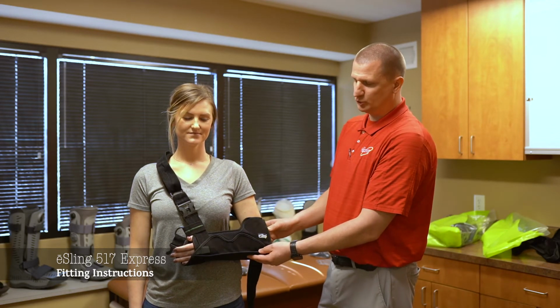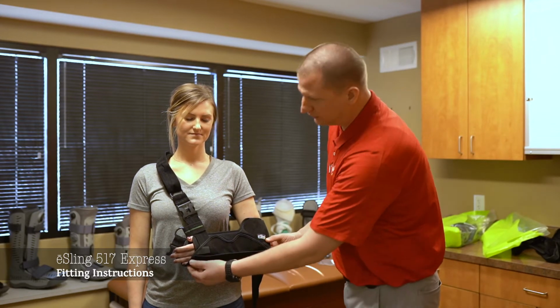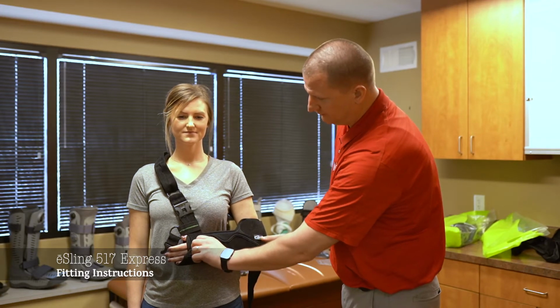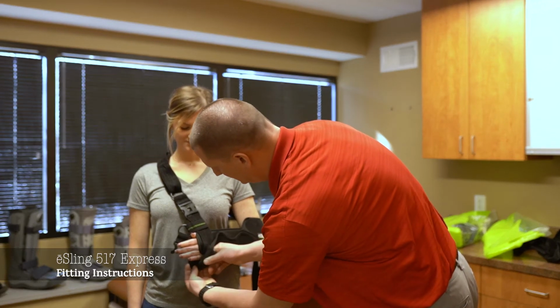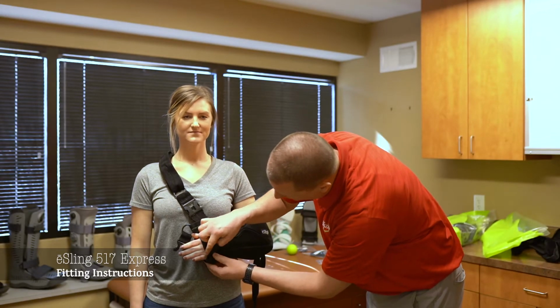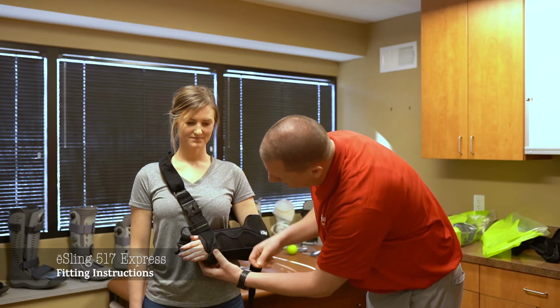After this is in a comfortable position, okay, and her elbow is all the way back, we will assess where the cradle goes past her hand. A feature of the eSling Express is that you can fold back the cradle for proper sizing. In general, we do not want this cradle to go past her knuckles, and you're able to Velcro this down like this on both sides.